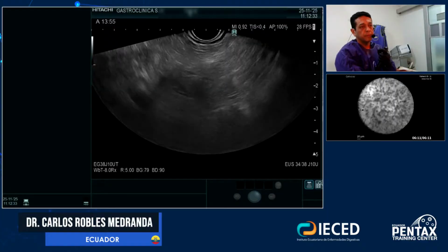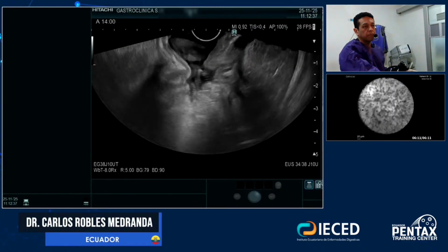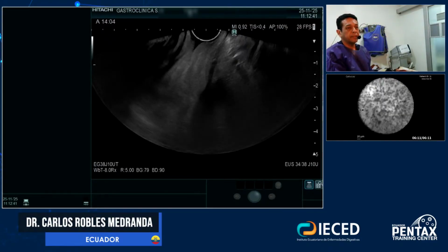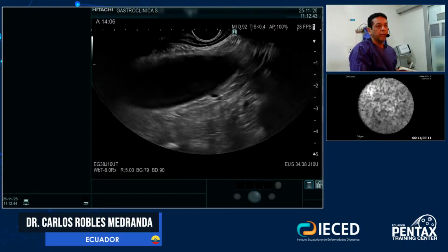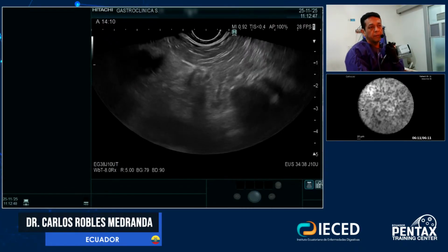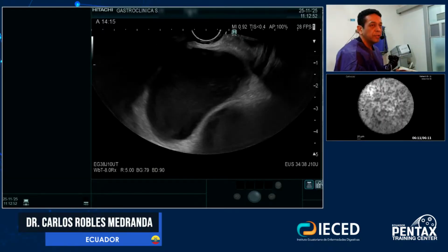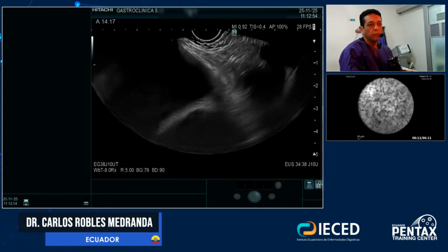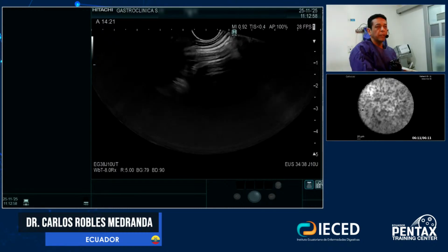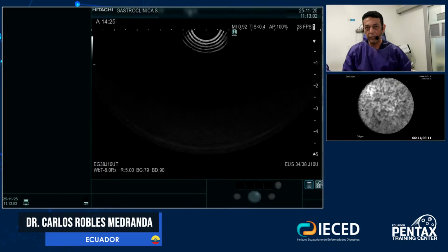So we saw the pancreas also, and the mediastinum is fine. Okay, so in general, I believe whatever it is as a lesion, I always say this is a difficult lesion to be diagnosed by B modes. B modes have less than 50% in all series when it's compared to other technologies in terms of cystic lesion diagnosis.